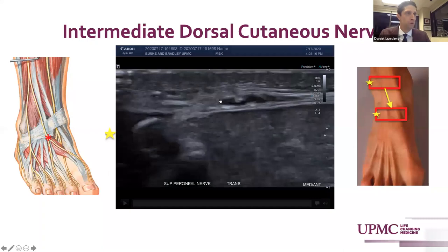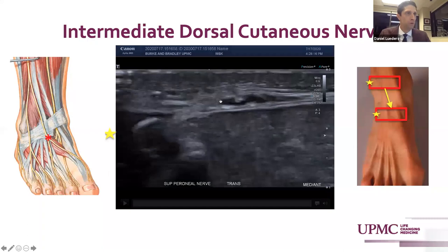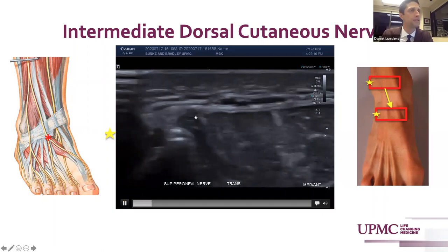Moving posteriorly from that, here we'll see the intermediate dorsal cutaneous nerve of the foot, coursing more laterally as it innervates the dorsal fourth and fifth rays of the foot.